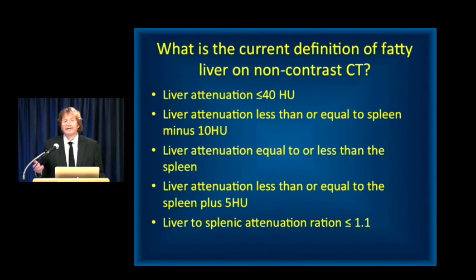What are the current definitions of fatty infiltration of the liver? The first thing is that people have shown, and it's a good point, that if you're going to look for fatty infiltration of the liver, you don't need contrast CT. You want to do a non-contrast CT. That gets around all of the issues with timing.